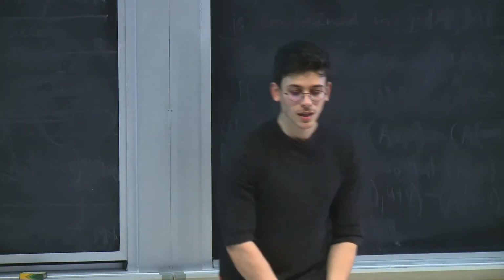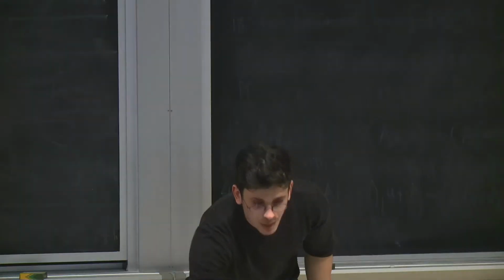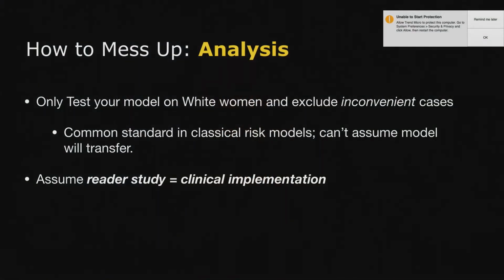And the last part, in terms of how to mess up, is this kind of analysis. One thing that's common is people assume that synthetic experiments are the same thing as clinical implementation. People do reader studies very often, and you might find that computer detection makes a huge difference in reader studies, but you can't actually show it in real life, or it was even harmful. It's important to do these real-world experiments to really say what is happening and whether this gives the real benefit that I expected.